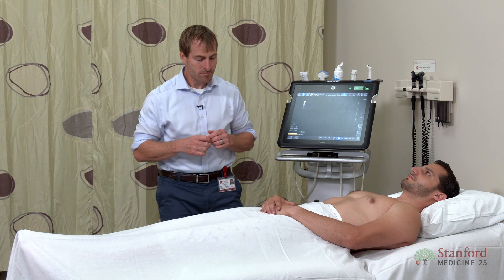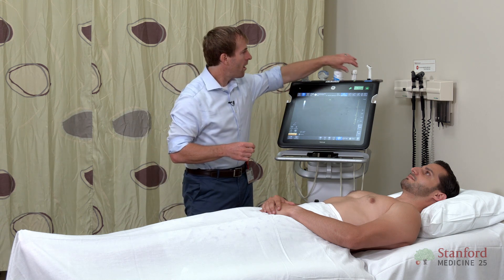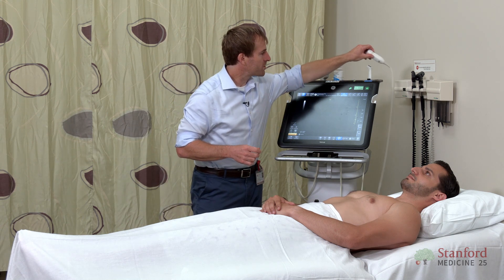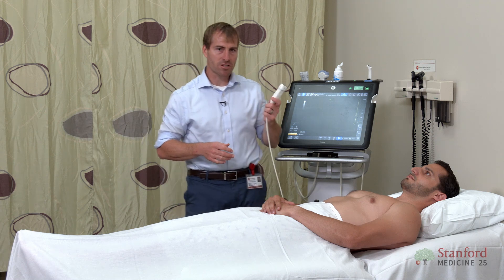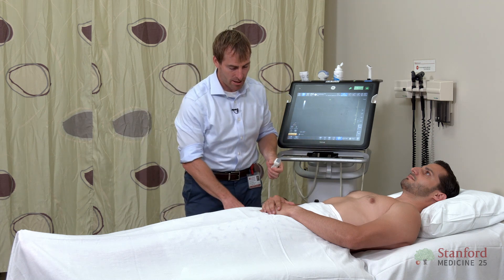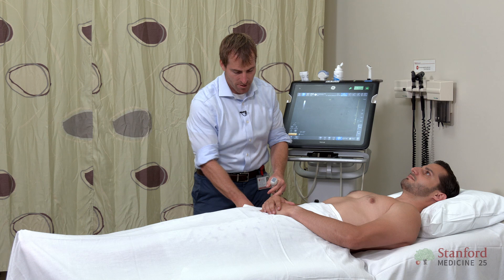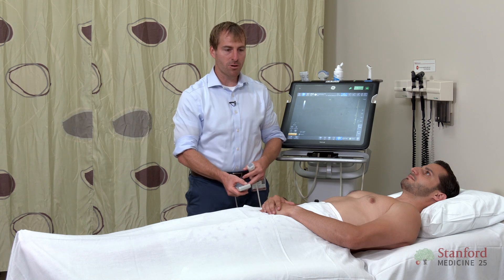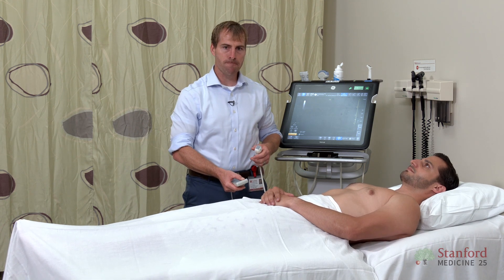Now let's go ahead and get the probe. Before you even start scanning, we need to make sure we've got everything set up. I'm going to go ahead and adjust my bed — we want to save our backs, so let's move the bed up a little bit.